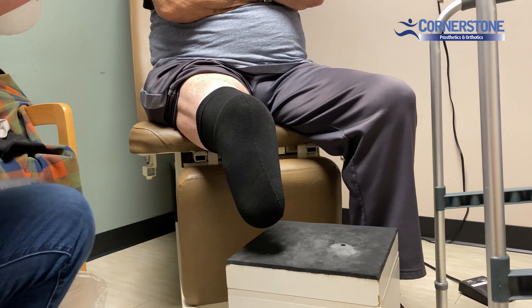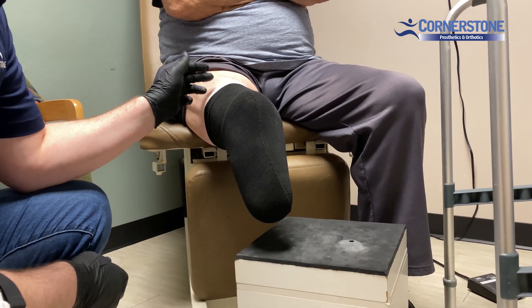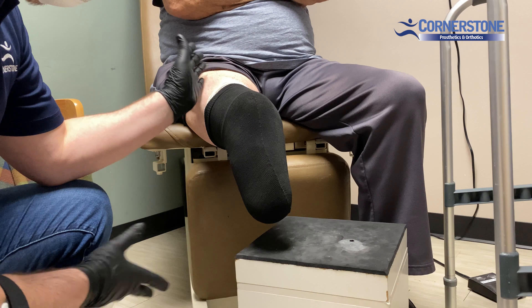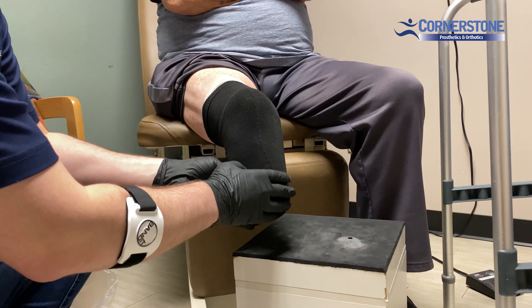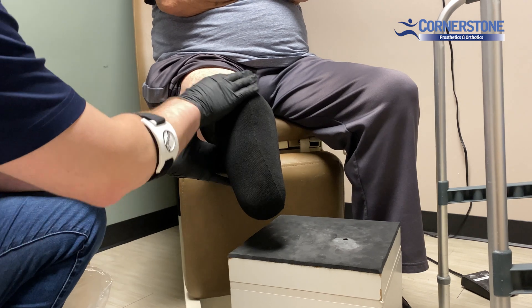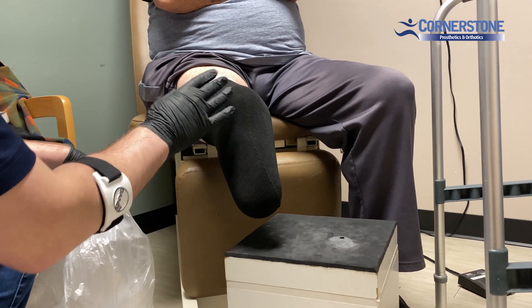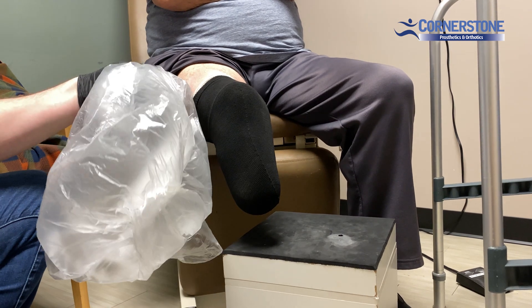The setup is pretty simple. We have our limb with liner, gel sock, or whatever interface they're using, and then we have whatever sock ply we are over that. For today, this patient has a two ply fit, and what we're going to do is to protect the sock and the liner from the silicone — we're just going to use a standard trash bag.